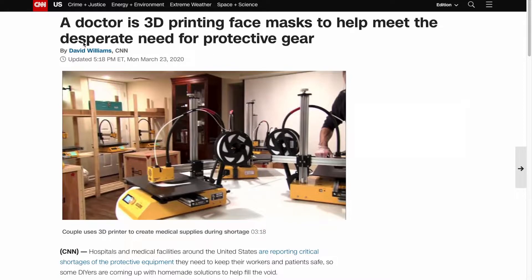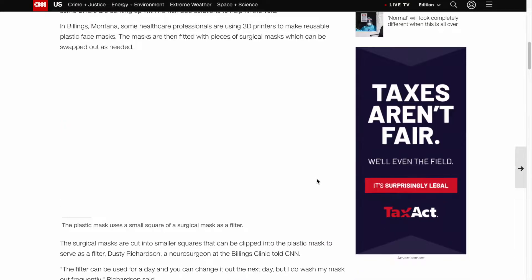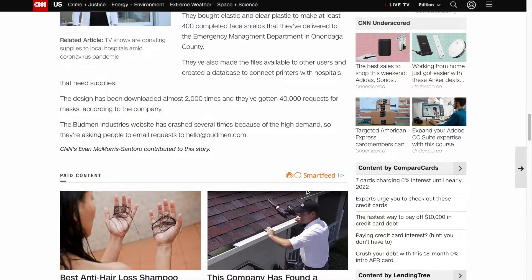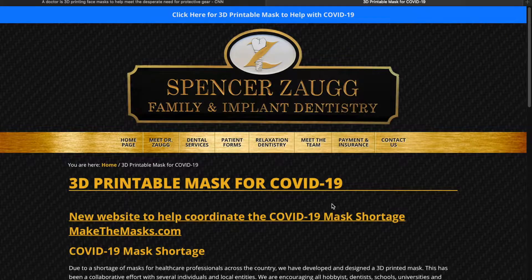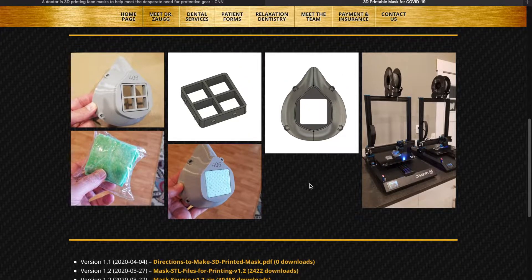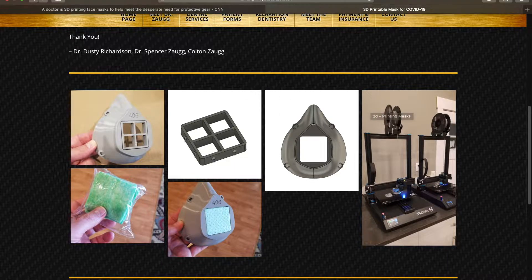I first got interested in 3D printing masks for the coronavirus when I came across this CNN article about how a doctor was 3D printing masks to help meet the needs for protective gear. I thought that was really cool, so I came down and saw this mask he was making. I was thinking I could do that — I've got a 3D printer. It'd be really easy for me to do. I clicked on the files, it took me to a website, and I was able to download the files on how to make it.